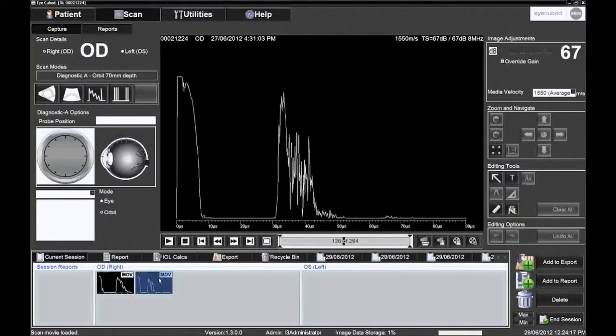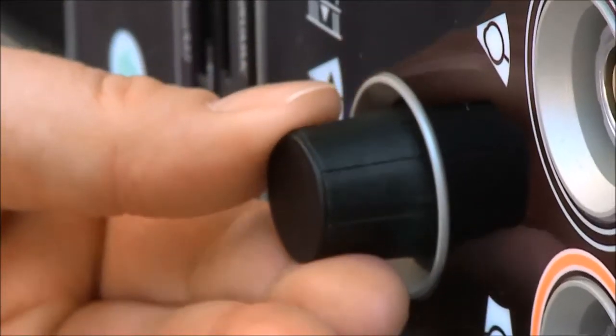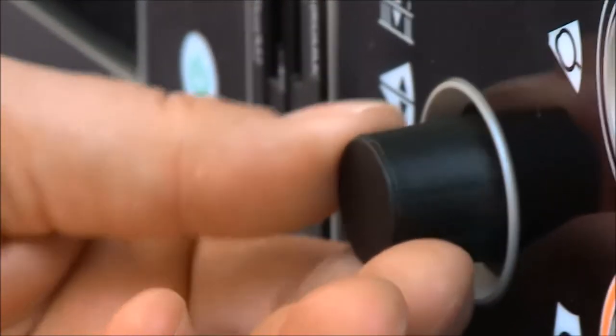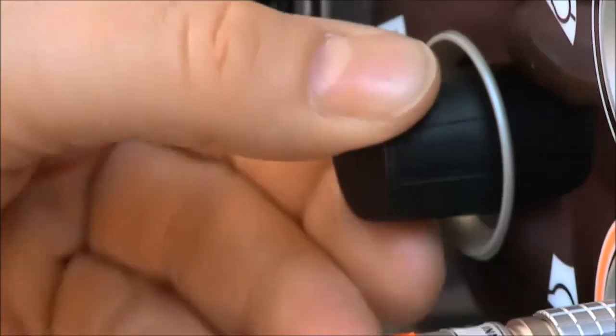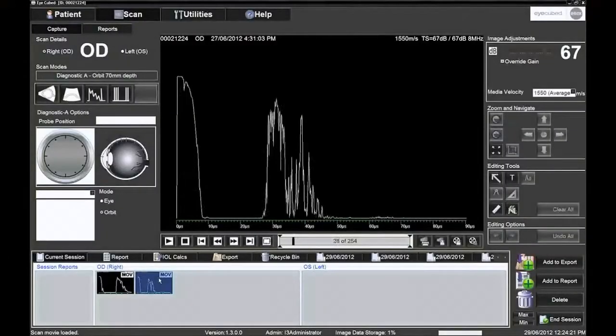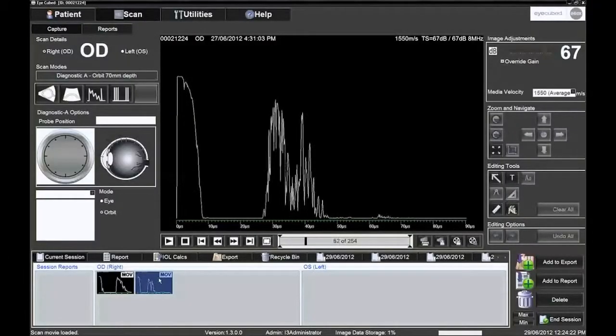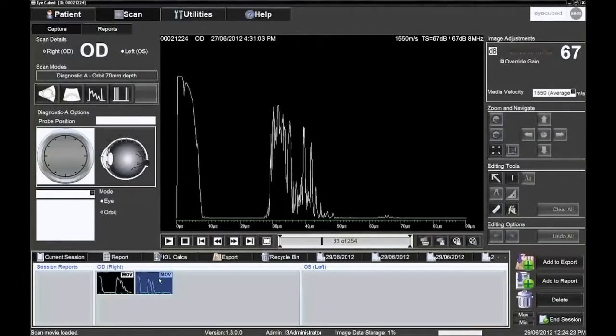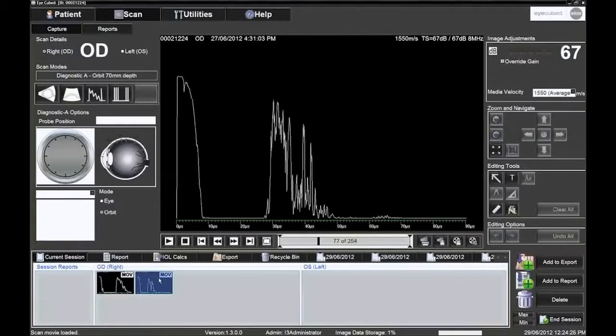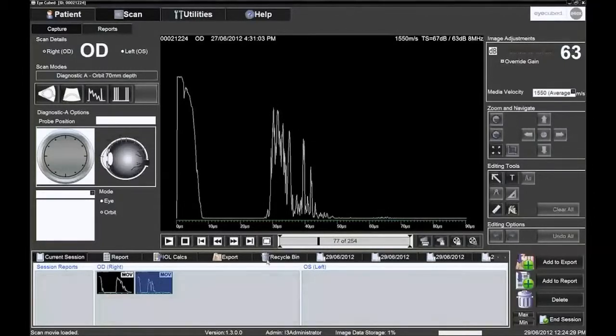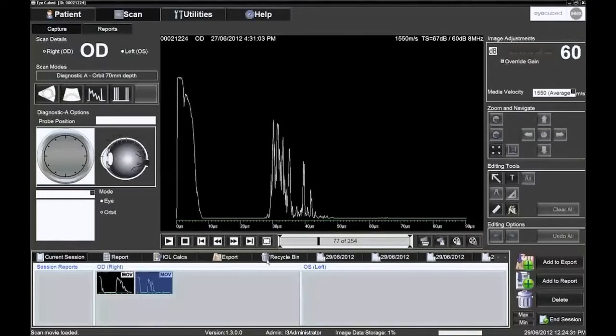The operator can then go back frame by frame using the mouse or by turning the second black knob on the front panel to re-examine different aspects and images of the pathology at their desired pace. The 254 frames can also be played as a movie and then saved as individual images or as a movie.